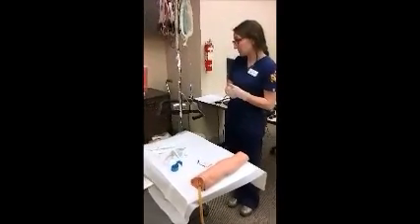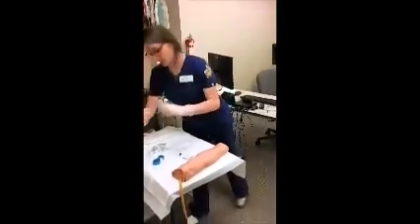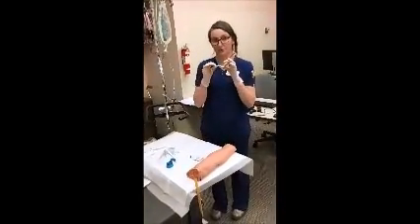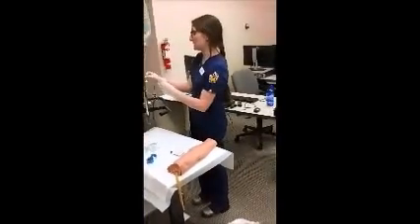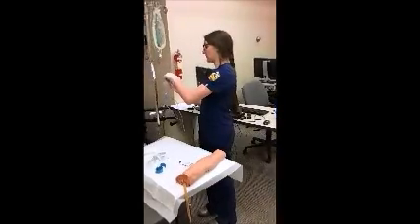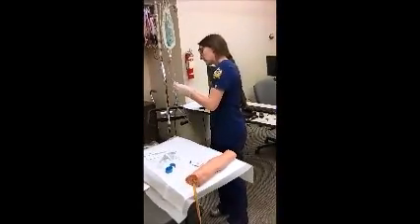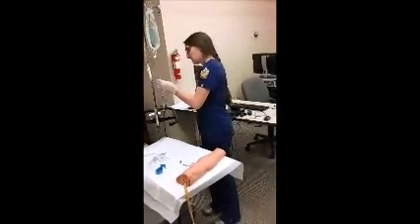One other thing we would also do, just to be double sure, is to label the tubing. I prepared a label ahead of time that has the patient's name, date of birth, and the time at which the tubing was placed on the IV. Some medications require different tubings and they have to be changed every so often. So you just want to go ahead and label that. And then we will transport everything to the patient's room.